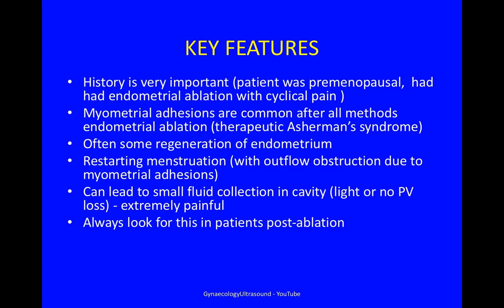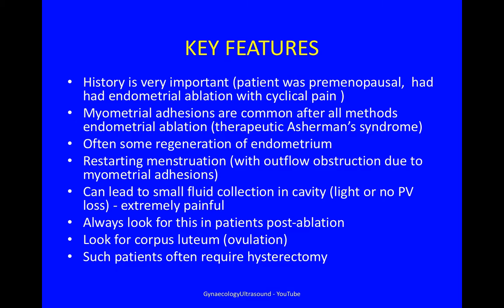You should always look for an endometrial fluid collection in patients post-ablation. Look for the corpus luteum to show they're ovulating. Such patients often require a hysterectomy.